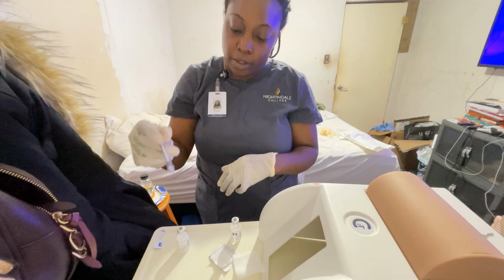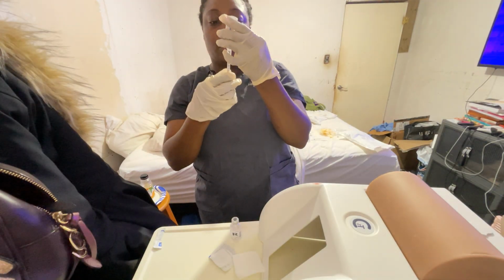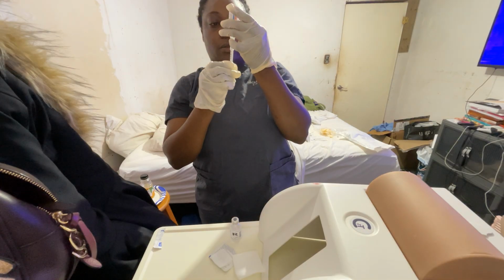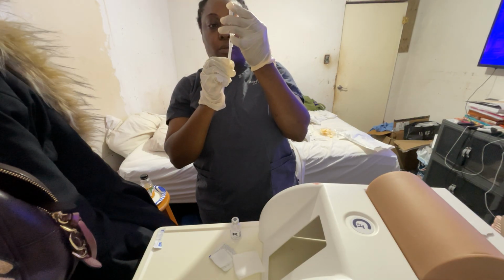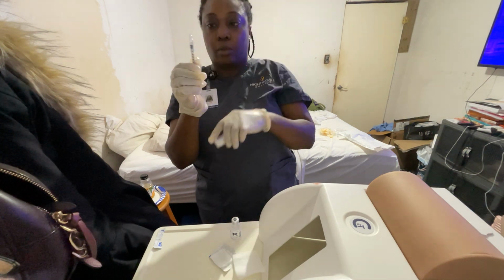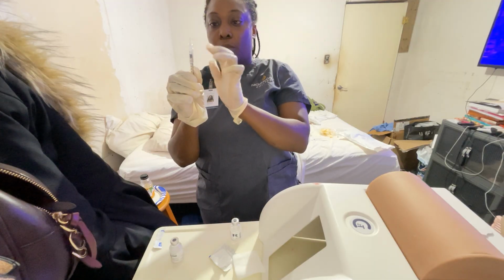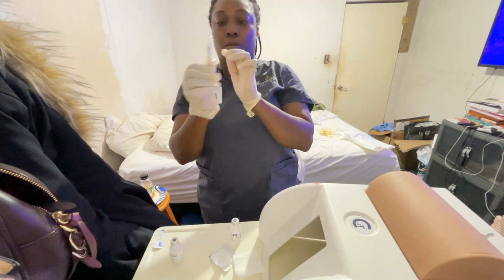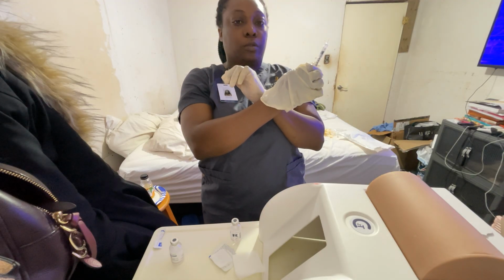I'm going to take my next vial and draw up 8 units. There's 8 units there.